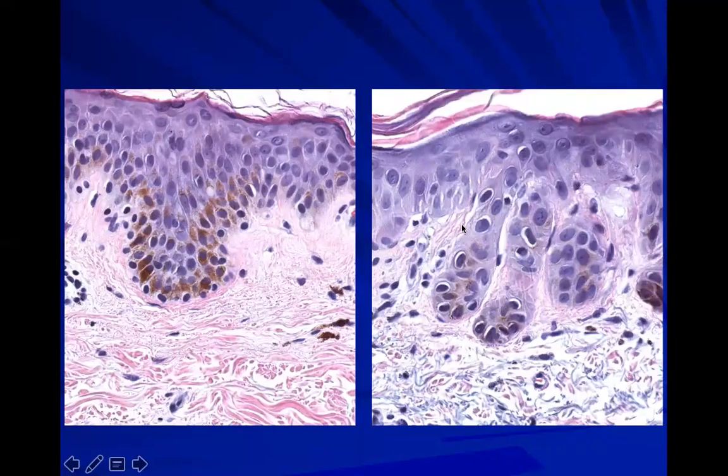This is just a side by side. This was a solar lentigo. You see, the basement membrane is going to be smooth. Keratinocytes have a basement membrane that connects them to the dermis via the hemidesmosome. Whereas here, you don't have that. You have this pearl necklace. So this is a lentiginous nevus, or if it's just a few less melanocytes, it's a simple lentigo. A simple lentigo is on a continuum with a lentiginous nevus, whereas a solar lentigo is keratinocyte pigment.